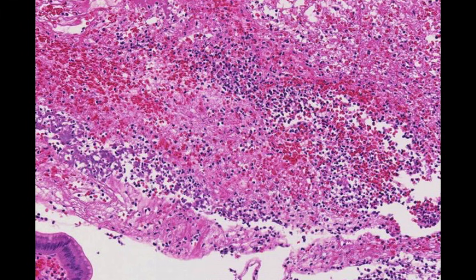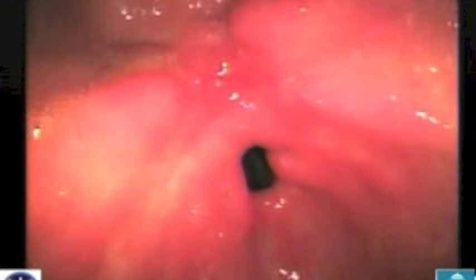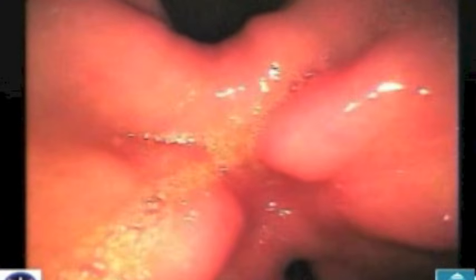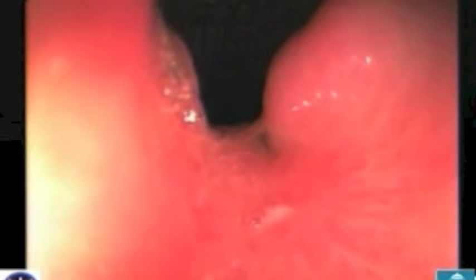The non-invasive treatment for this ulcer includes cessation of the COX-2 inhibitor medication and proton pump inhibitors, which work to decrease parietal cell HCl production. After 5 weeks of therapy, the area is completely healed, leaving behind only scar tissue.